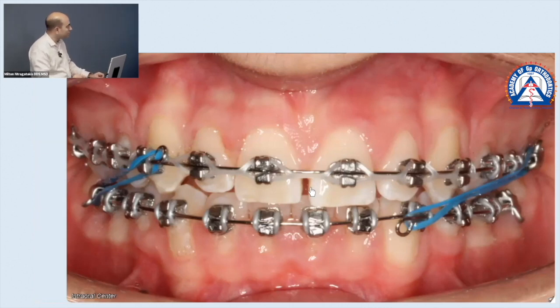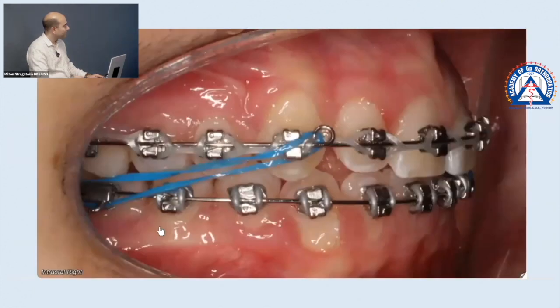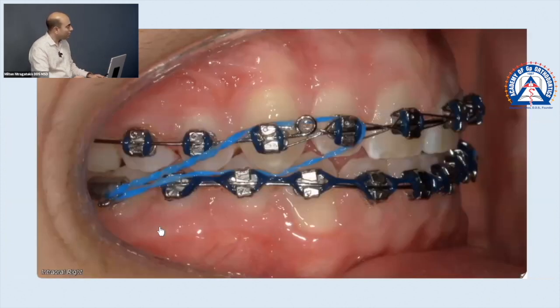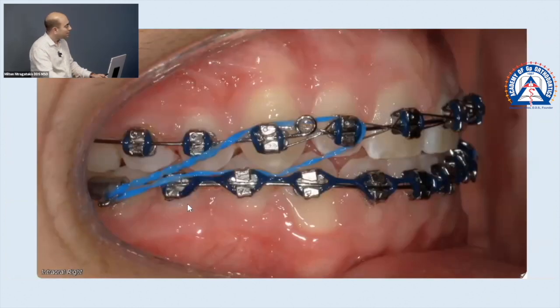Let's see if it worked. So this was back in June. Boom. Look at this. We linked through the power chain all the way down to the 6. Okay. We added the blue class 2 elastic on this side, and all the space closed towards the posteriors, not away from it. Right? Before, after.